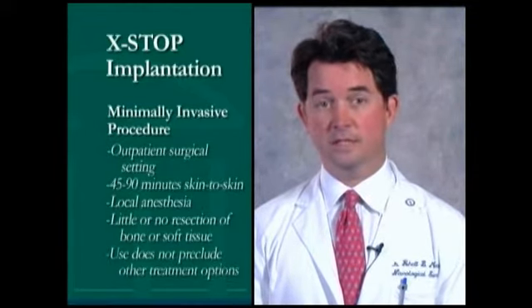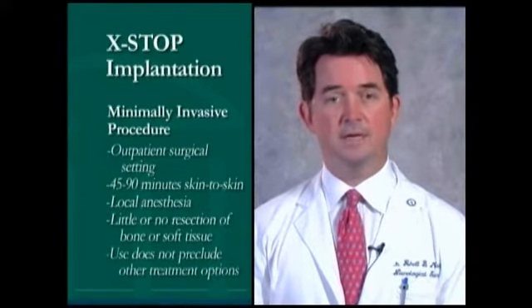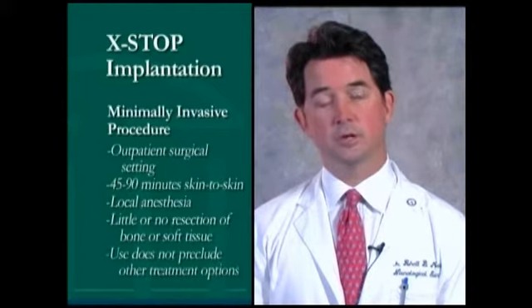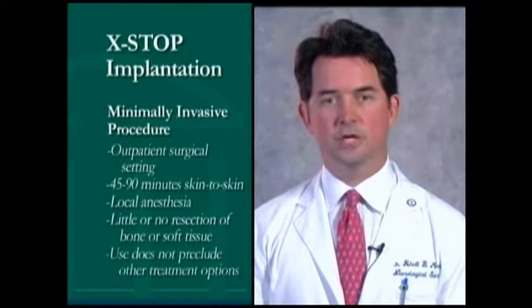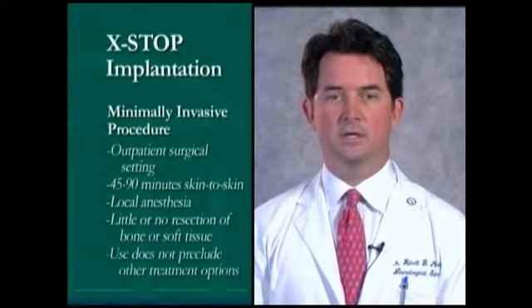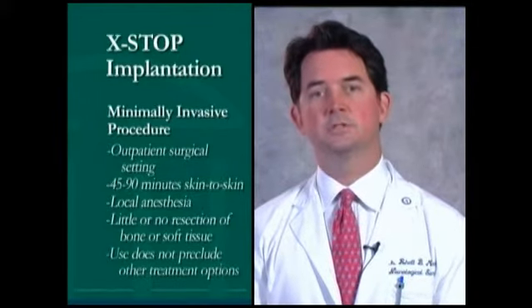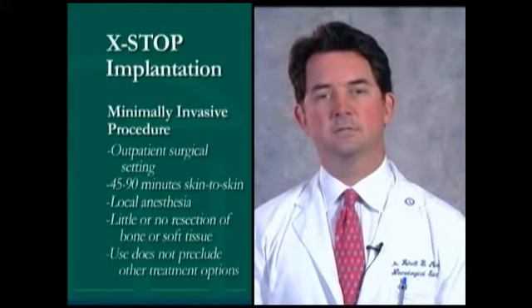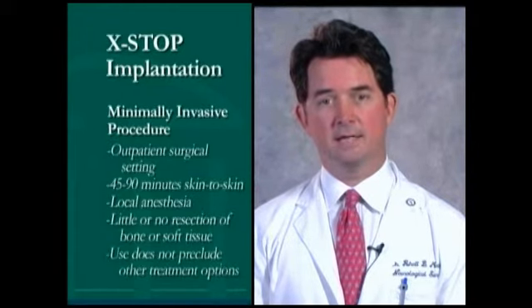Implantation of the procedure usually takes about 45 minutes, skin to skin. It can be done under local anesthesia, but also under general anesthesia. It requires little or no resection of bone and minimal dissection of soft tissues. The beauty of the X-stop is that it does not preclude any other treatment options, and if it fails to relieve the symptoms, more conventional surgery can be done at the same level at a later date.